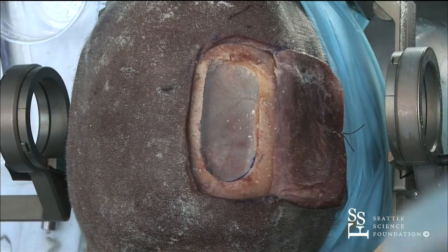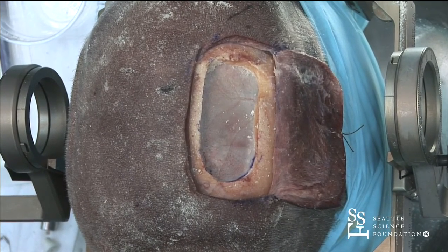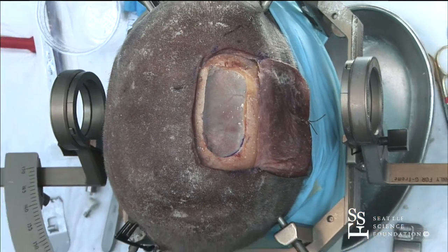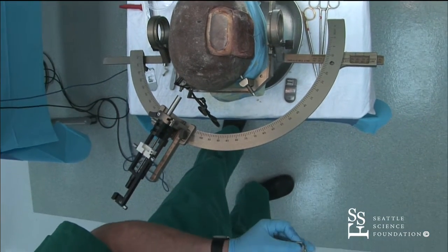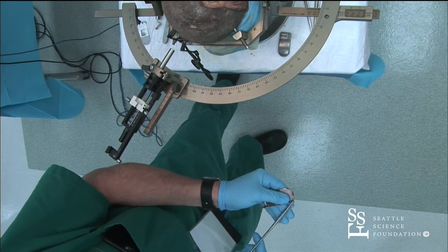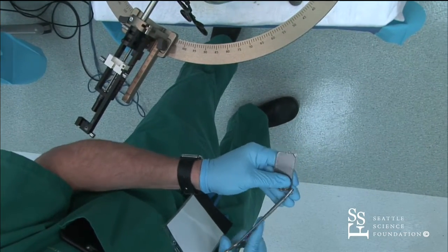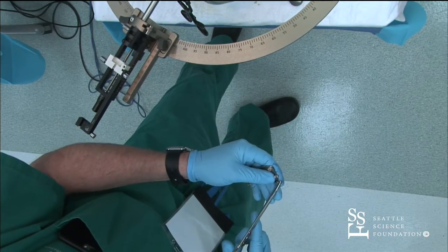So I would probably bend these down a little bit more to get it a little bit deeper. And when this comes, all of the tabs are up except for one. There's one that's pre-bent, and the rest you have to bend yourself. So typically, I will bend a little bit less so it sits a little bit deeper, and then it's not as palpable later.